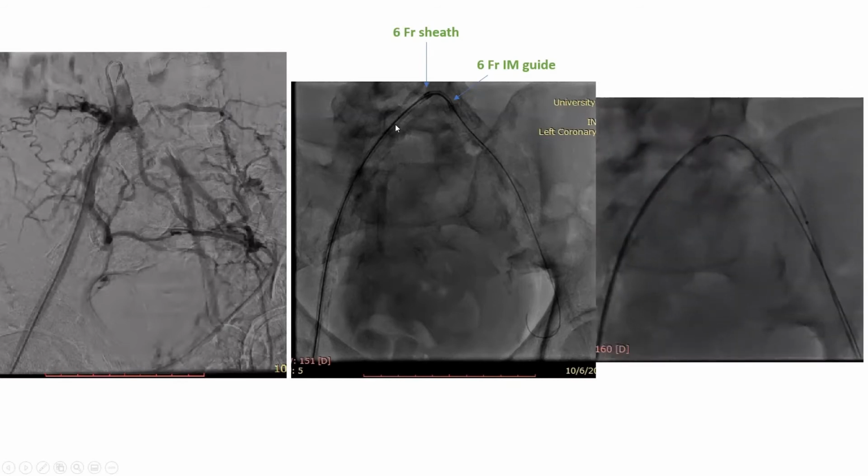So I placed a 6 French supportive sheath, then through it a 6 French IM guide to embrace that bifurcation. And through it, I pushed the glide wire and a quick cross catheter. You see, it's hard to see the body of the quick cross catheter. It's probably here. I was able to push them through. Then after I pushed them deeply, I was even able to advance the IM guide through it. Then I ballooned that area. And after I ballooned that area, it was easy. I had already recanalized it.